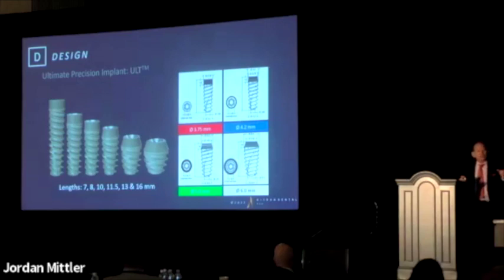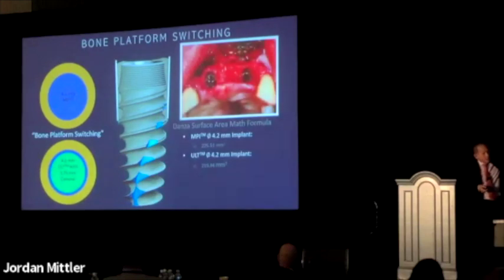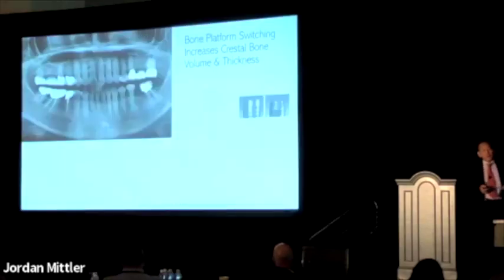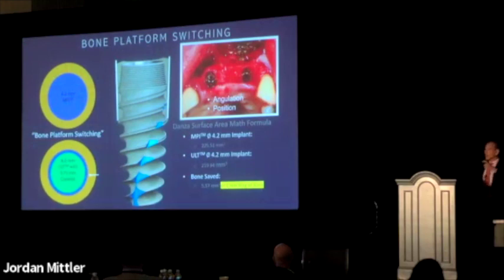Or how, depending on the size of the implant, obviously, for me. Therefore, thickening the volume of bone and thickening the soft tissue. So when I look at this type of design, you see what it does. In this particular case, all I did was reposition about 1 millimeter. If you're using a 4.2 diameter implant, based on the study that they showed, you're getting about a 1 millimeter ring of bone around the implant, an extra millimeter of bone. That translates to another millimeter of soft tissue thickness.